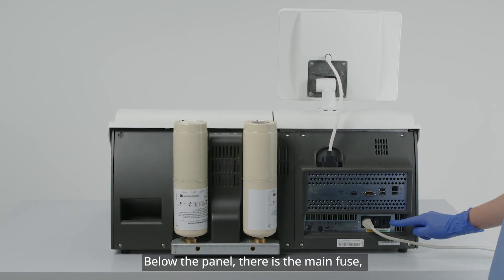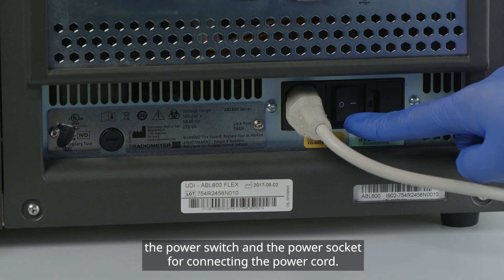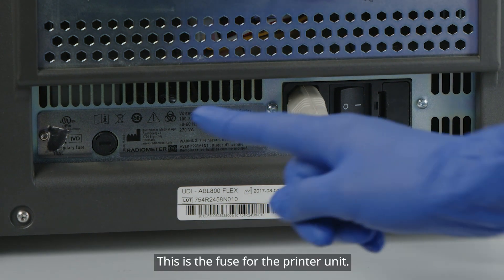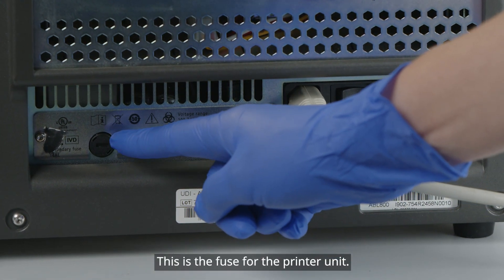Below the panel, there is the main fuse, the power switch, and the power socket for connecting the power cord. This is the fuse for the printer unit.